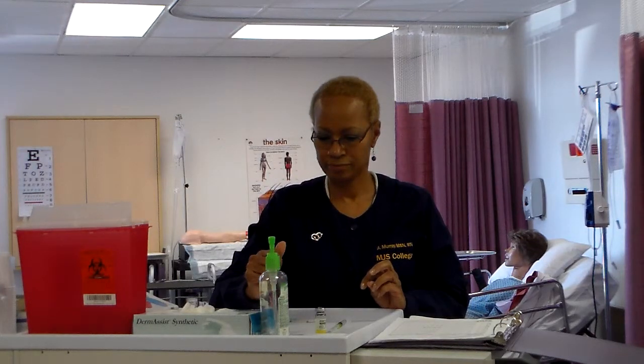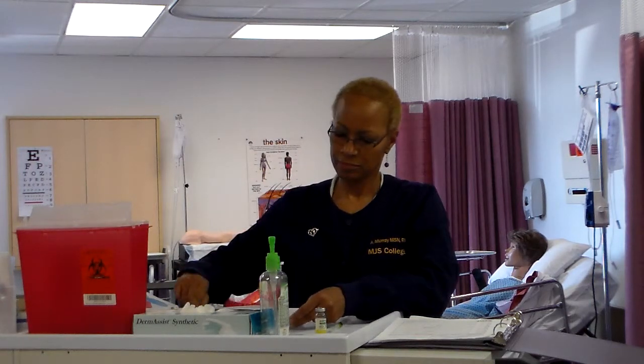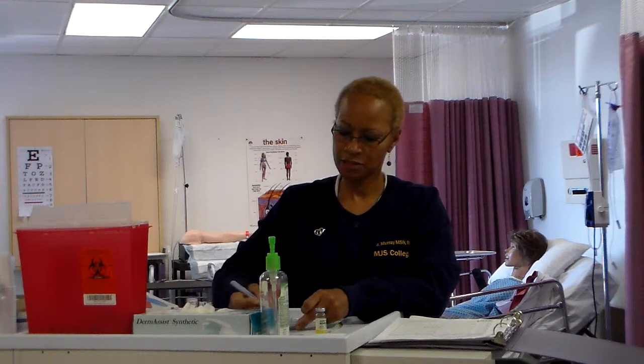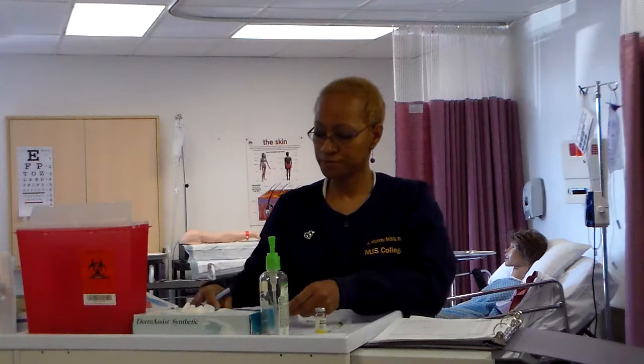Okay. For multi-dose vial, make label that includes time and date of mixing, concentration of medication per milliliter, and your initials. Okay, so I have the date, I have the time, I have the medication, the concentration, whatever number of milligrams per milliliter, and my initials. And I would apply that to my vial.